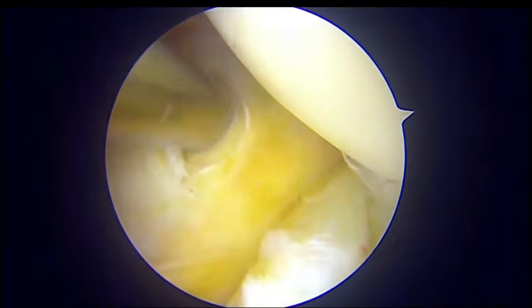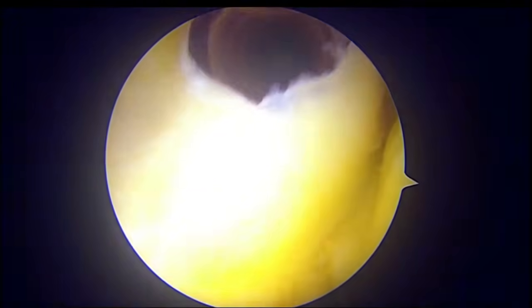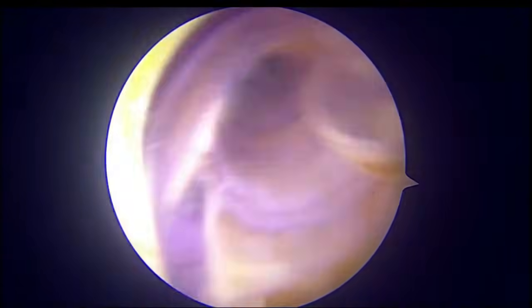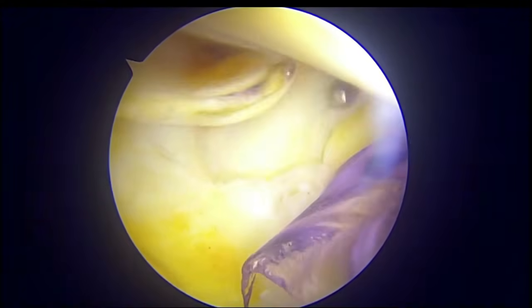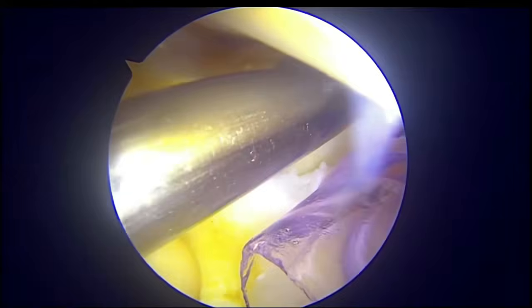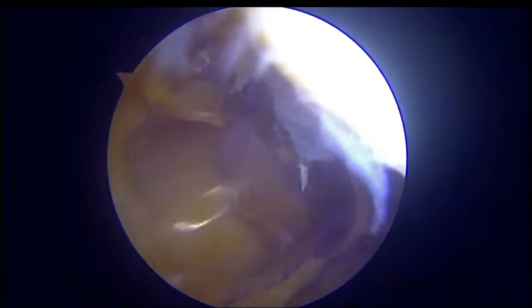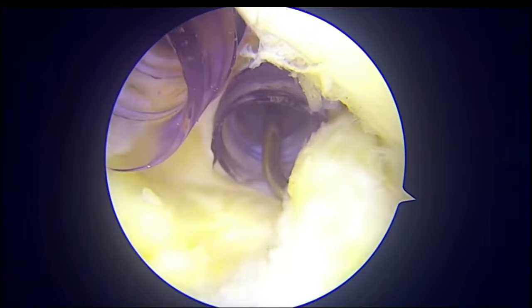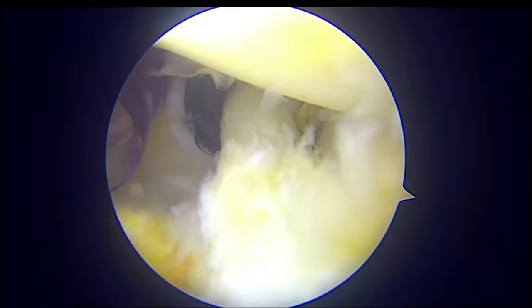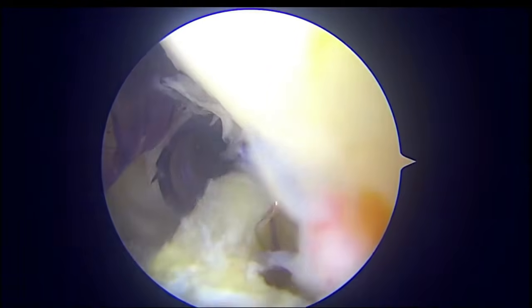Coming to the repair, we first put the needle, and then with the number 11 blade, we make the incisions. Then the Wissinger rod is put inside, and we dilate it and push the plastic cannulas inside. Again, we need two portals, the posteromedial superior and posteromedial inferior portals. So we can see the two cannulas inside. And now with a lasso, we are trying to put the sutures.